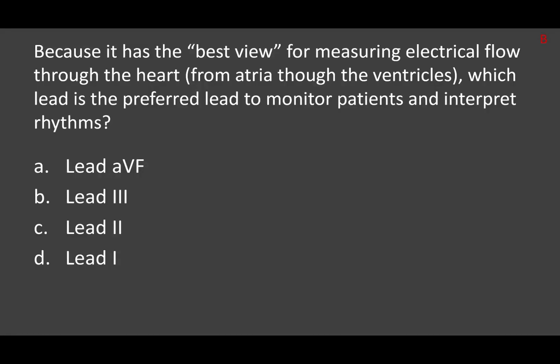Because it has the quote-unquote best view for measuring electrical flow throughout the heart from atria through the ventricles, which lead is the preferred lead to monitor patients and interpret rhythms with? That's the lead that we pretty much have everything on throughout this entire course. We don't really use AVF for much. We've only briefly talked about lead 3 or lead 1, so lead 2 is your big guy. Lead 2 has the best overall view of the heart.